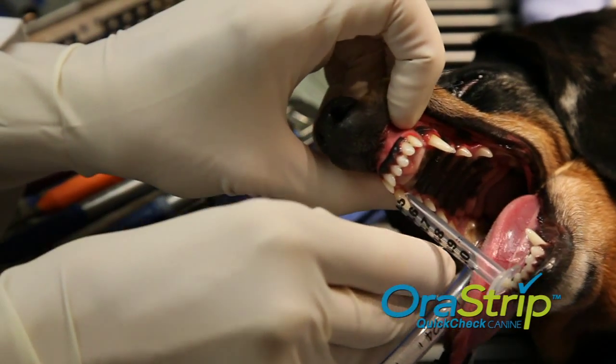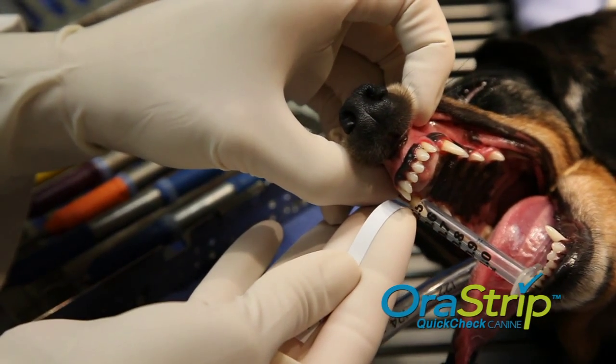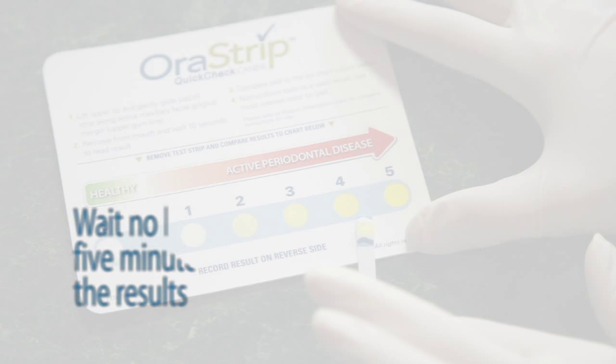Once the sample has been collected, remove the test strip from the dog's mouth and wait 10 seconds before reading the results. For optimal results, read the OraStrip Quick Check within 5 minutes of sample collection, as color on the pad tends to fade.